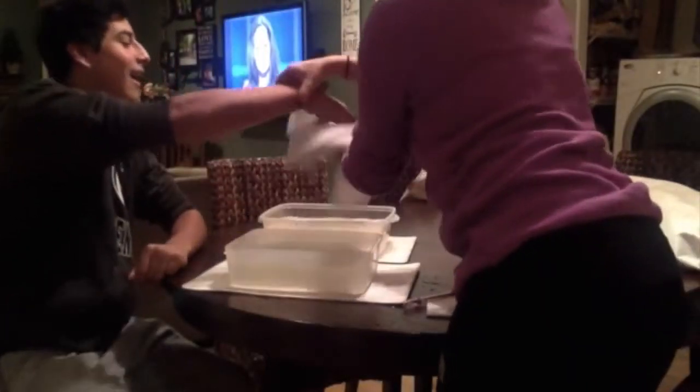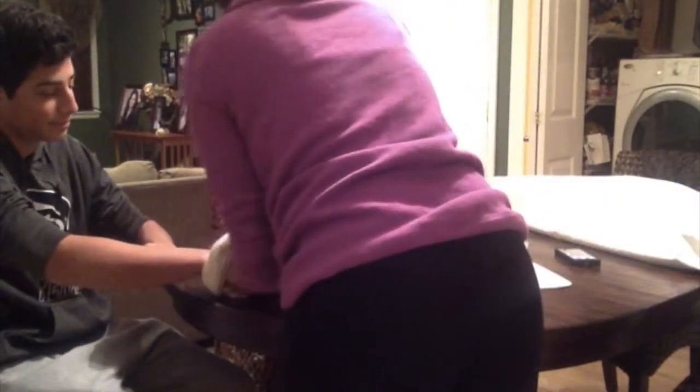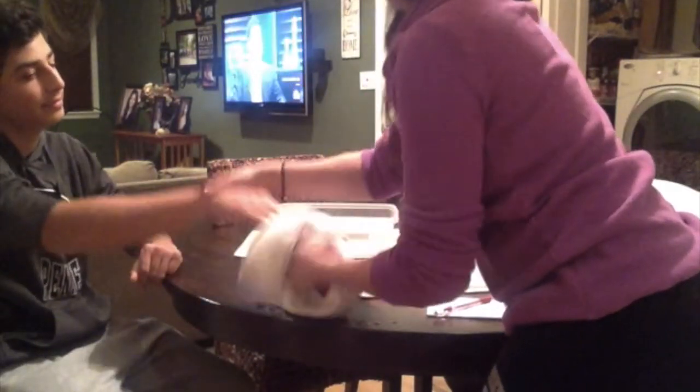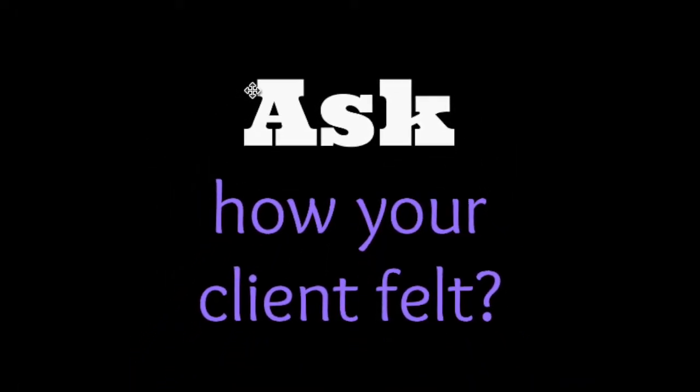Upon completion of the contrast bath, make sure that you have a dry towel ready. Ask your client their thoughts about the contrast bath. Did they like the hot better? Did they like the cold better? Was there a tingling sensation? Maybe they felt stabbing. This is all important information for you to gather.